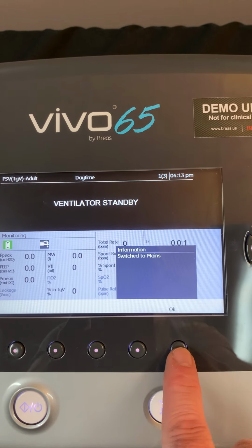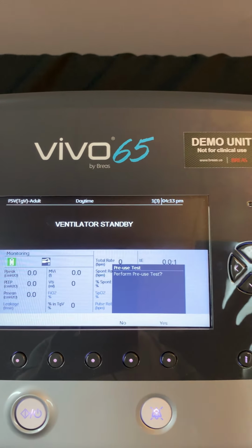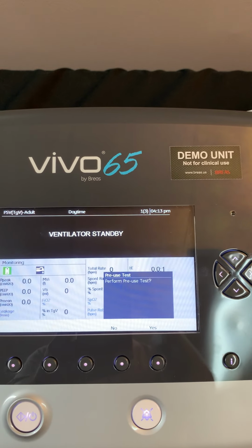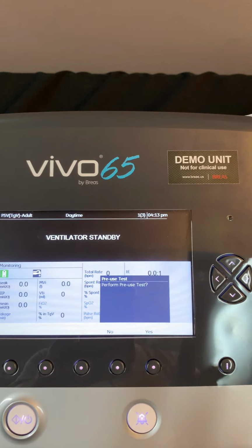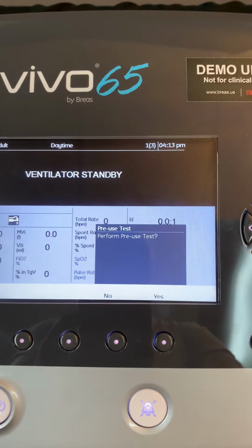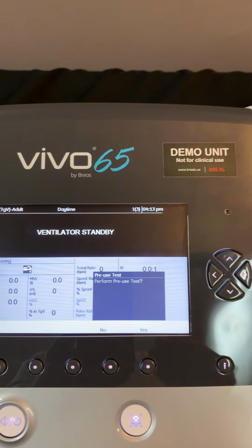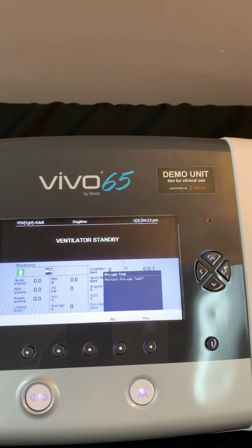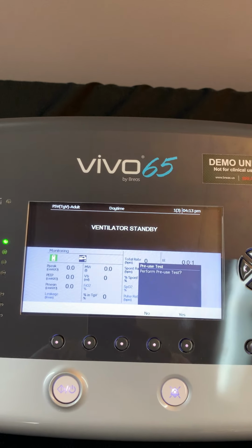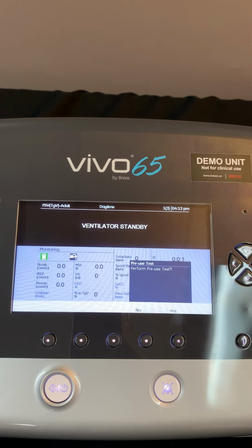There is a button underneath the word OK. You just simply hit that button, and you're acknowledging what information was provided to you in that message, okay? So the device is now asking, do we want to perform a pre-use test? You can either hit the no option or the yes option. Now, the pre-use test does two things. Number one, it's going to recognize the type of circuit that's attached to the device. And number two, it's going to compensate for the compressible volume that's lost in the circuit.